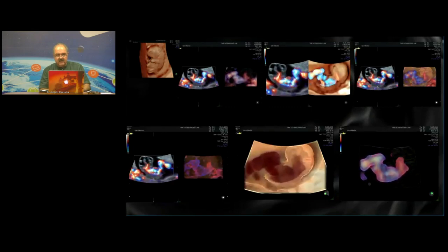If I want to play around, I can play around with the brightness and the intensity of this. All of this is possible by touch buttons at the bottom of my screen, and I will show you one such screen. And you can combine as much grayscale and as much flow information as you want. You can also get outline information, both on the grayscale and in here. And that's called silhouette gray, and this is called silhouette flow. And you can intensify that and see it like this.